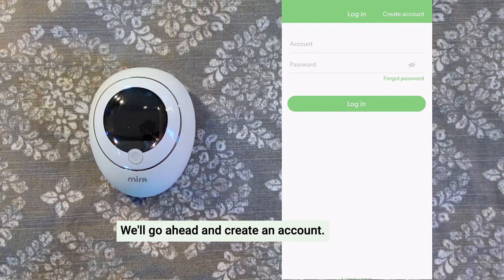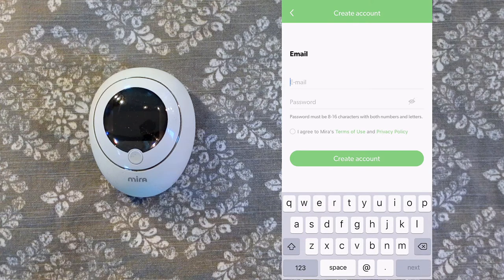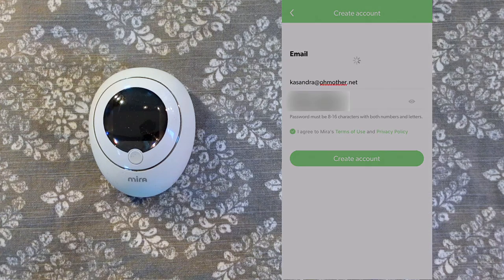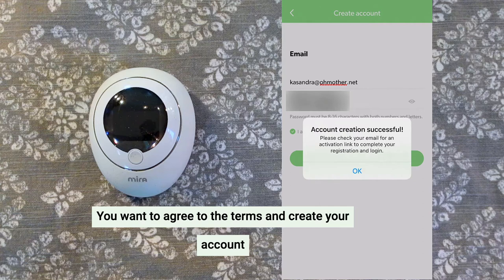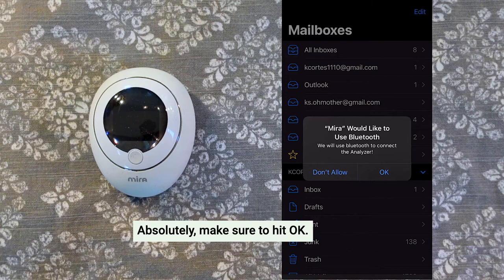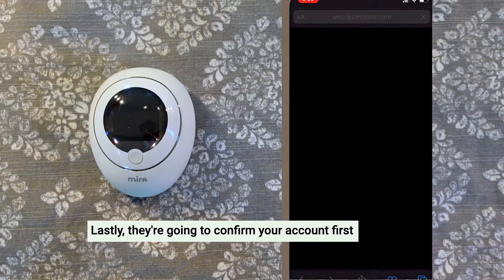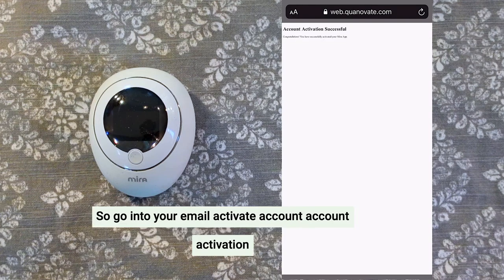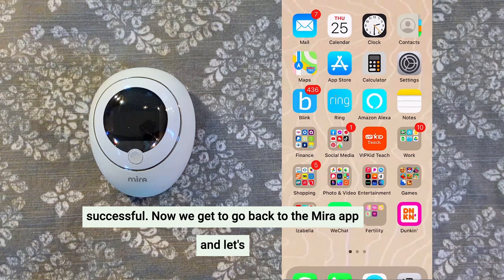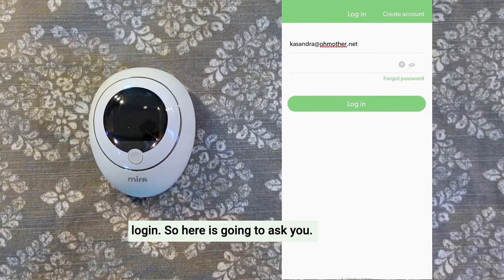We'll go ahead and create an account. You can pick an email and set a password. You want to agree to the terms and create your account. Mira will ask if you'd like to connect to your Bluetooth — absolutely, make sure to hit OK. Lastly, they're going to confirm your account first before you get to log in. So go into your email, activate your account — account activation successful. Now go back to the Mira app and log in.